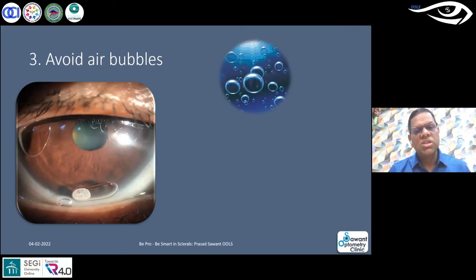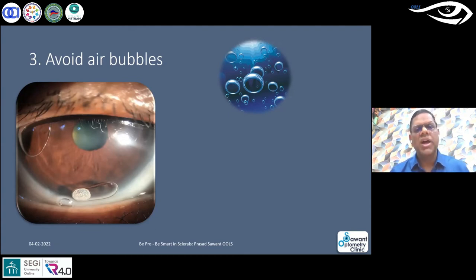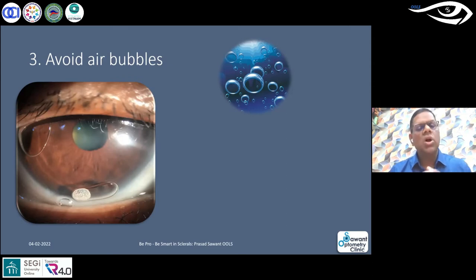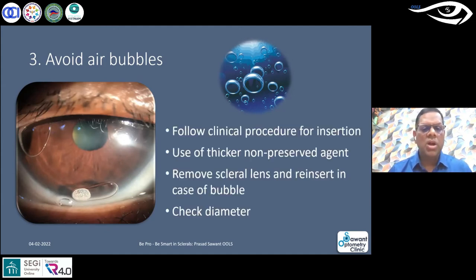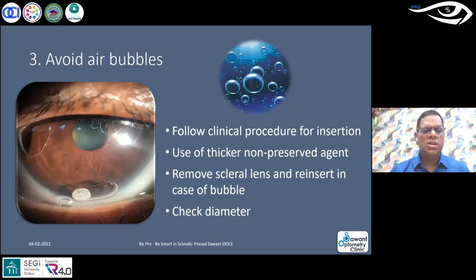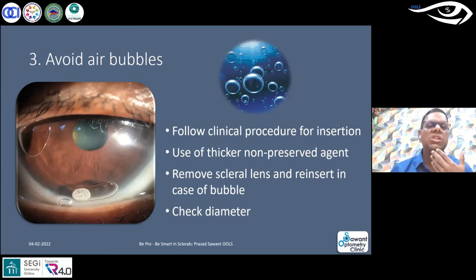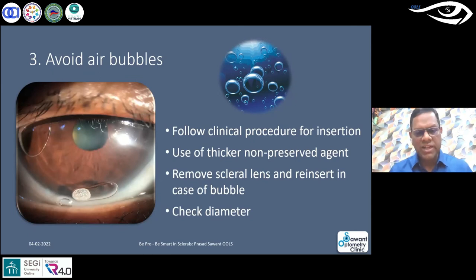If you choose the diameter, vault, and other parameters wisely for the first trial lens, and if you can insert the first lens without an air bubble, you have almost won the battle right there. Make sure that in the first instance there is no air bubble and you're done. Follow the thorough clinical procedure for insertion — ask the patient to look down, make sure their chin is tucked to the chest, and ensure a complete widespread of the lids.